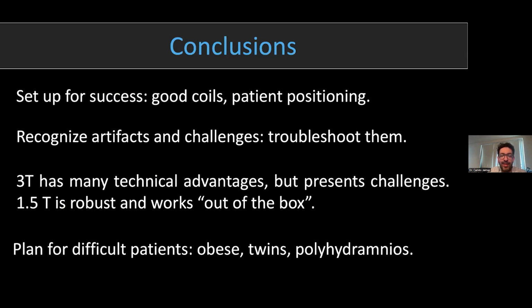I want to say that one of the most important things is to start with the best data possible. So set yourself up for success. Know your coils and invest in patient positioning. Recognize basic artifacts and challenges and how to troubleshoot them. You are likely to encounter them. I love 3T. It has many advantages, but it does present some challenges.